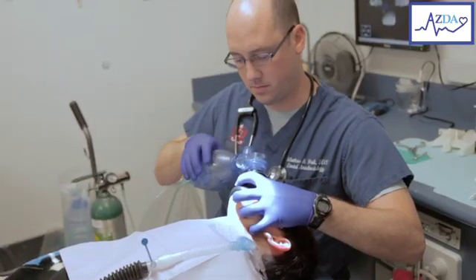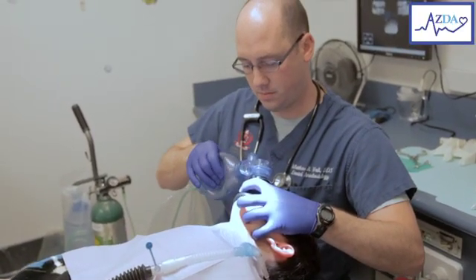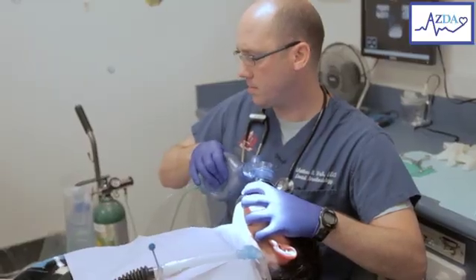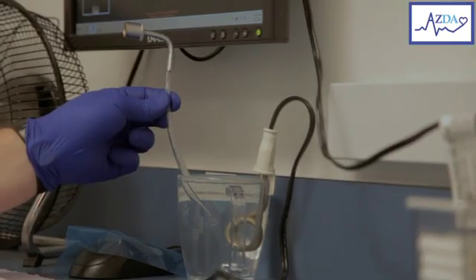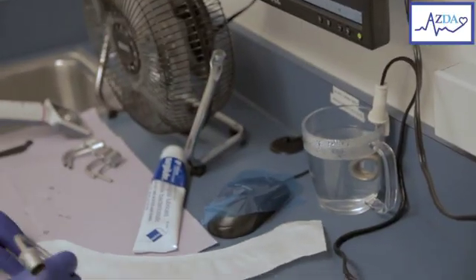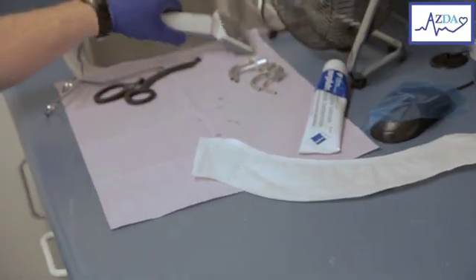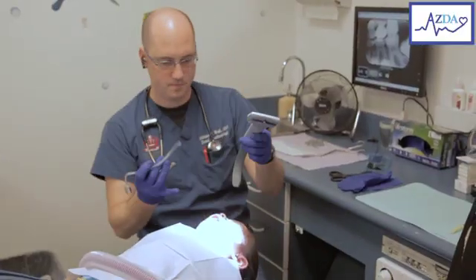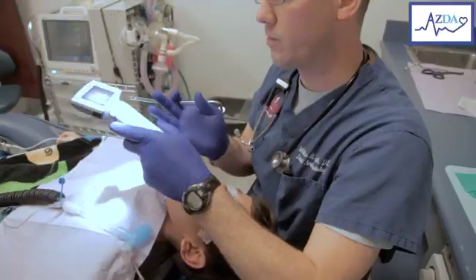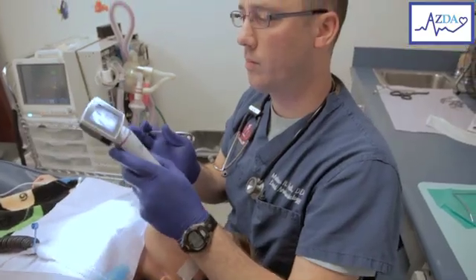The patient is now apneic and will receive a few breaths of 100% oxygen to build the patient's reserve. The endotracheal tube is gently heated in water to decrease trauma when the tube is inserted. Sometimes we also rub the tip of the tube in surgical lube to make sure that the tube moves nicely through the nasal passage.